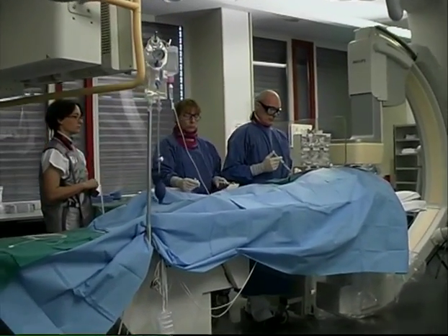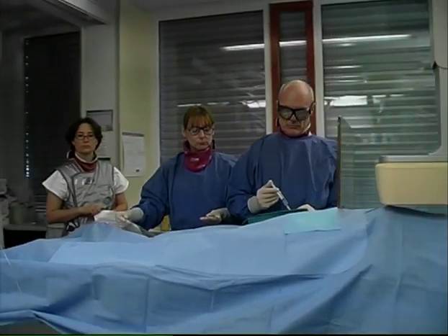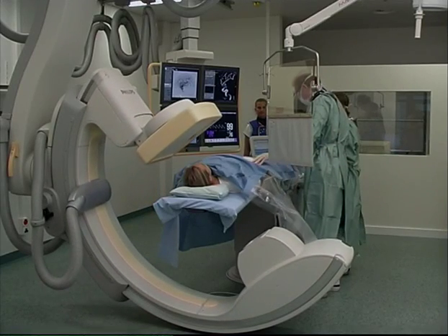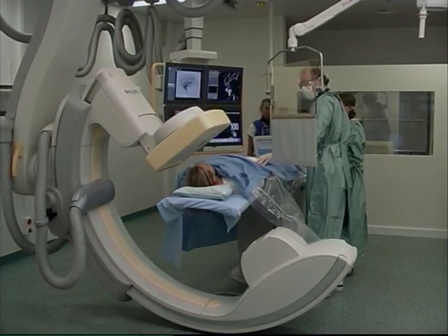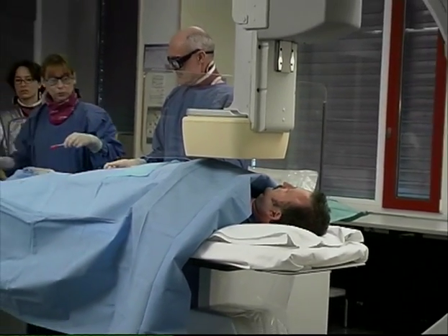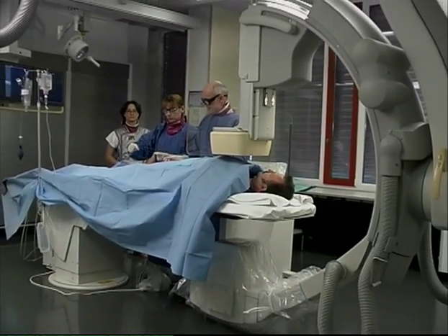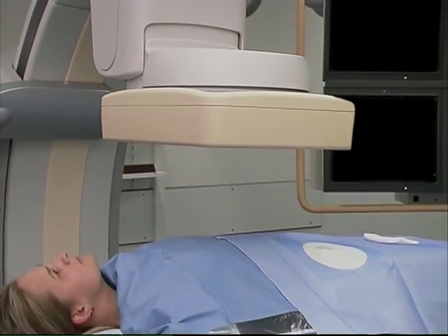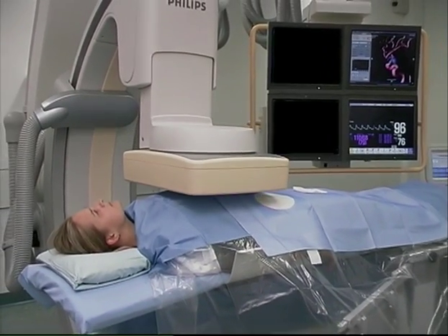All X-ray equipment requires operating approval from the appropriate authorities. The operating manual is the reference for information on how to correctly use the X-ray system. Detailed information on radiation protection, particularly scattered radiation exposure in specific work areas, can be obtained from the clinic's radiation protection expert. To prevent long-term damage, the procedures described, as well as the manufacturer's instructions, must be followed carefully.